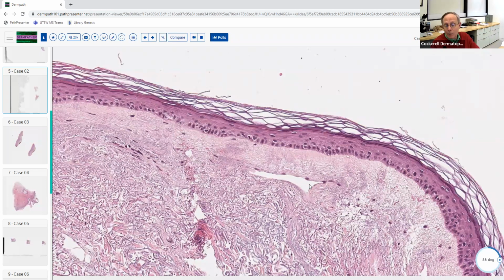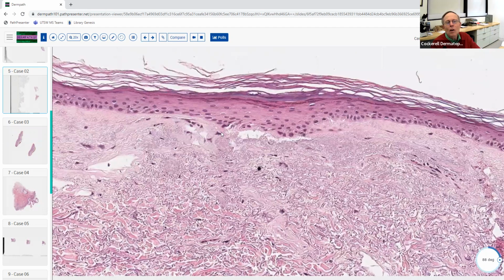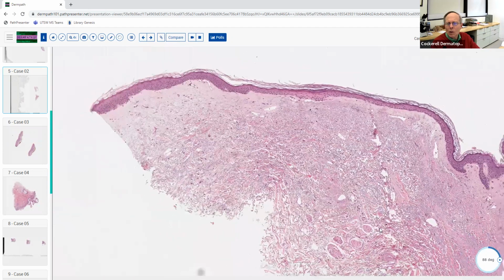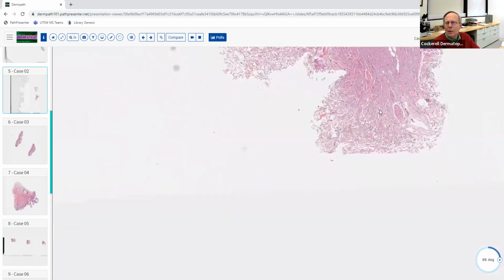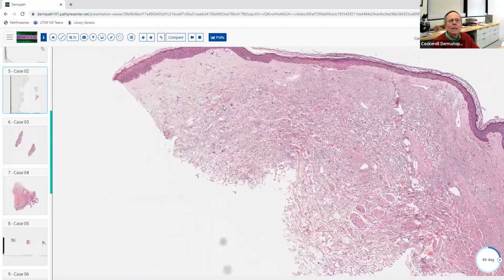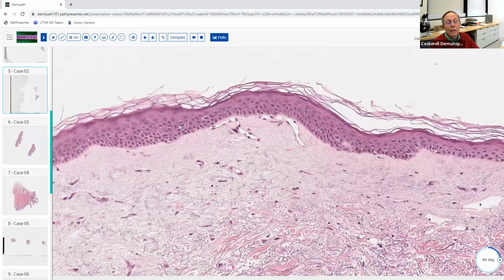And if you see dilated blood vessels, and you see sometimes, this one doesn't have it quite as good, but if you see some kind of irregular, bizarre fibroblasts, sort of like here, that's a good clue that that is very much likely the diagnosis. And notice that it's also relatively superficial. It's not going all the way down to the bottom here. It sort of seems like most of the changes are kind of up in this area right in here. So this is chronic radiation dermatitis. This field right here is really a nice example of that.